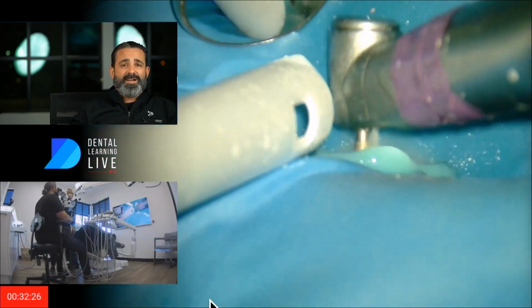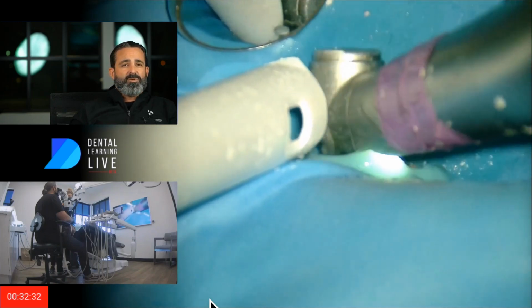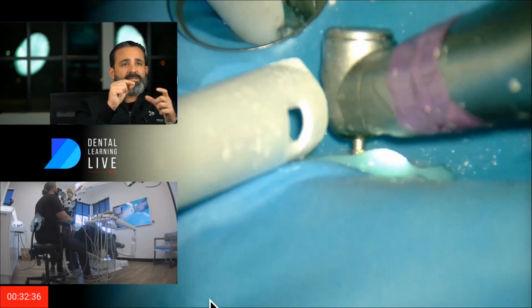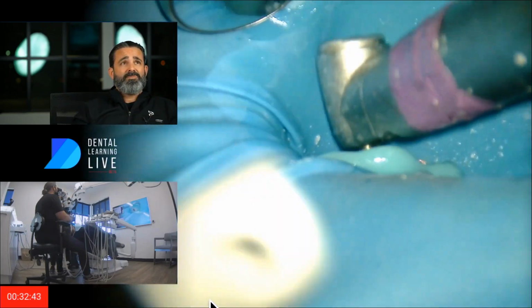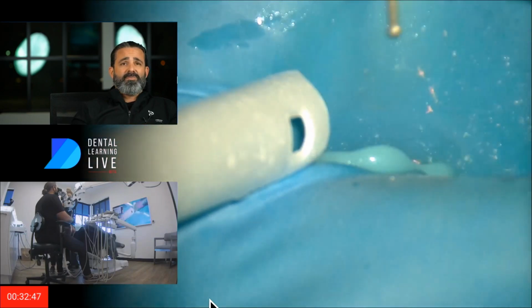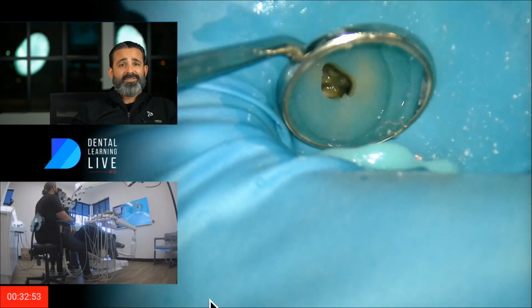I'm going to redefine my access, look for air bubbles. I've gotten to the point actually not to be such a cake decorator or a finished carpenter decorating the sound seal around, and voids are a thing of life and they happen, but they're almost easier to fix than they are to worry about if you create them. I'm sort of measuring my time on both those statements. And for me, it's actually quicker just if they exist, then fix it.